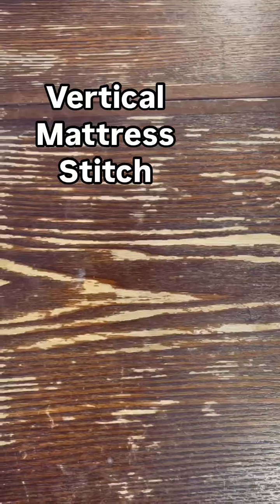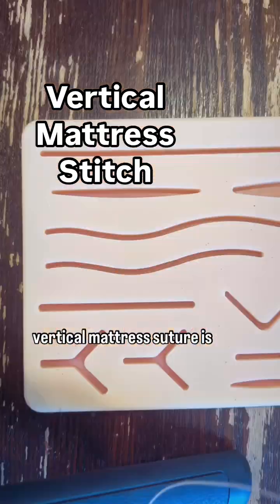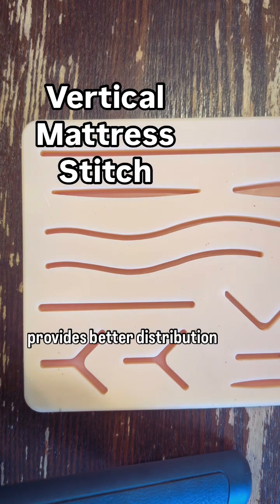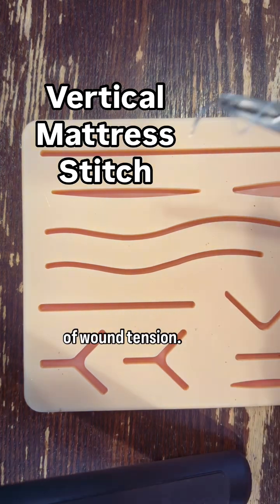Let's go over a vertical mattress stitch. The main indication of a vertical mattress suture is to evert the skin, and it also provides better distribution of wound tension.